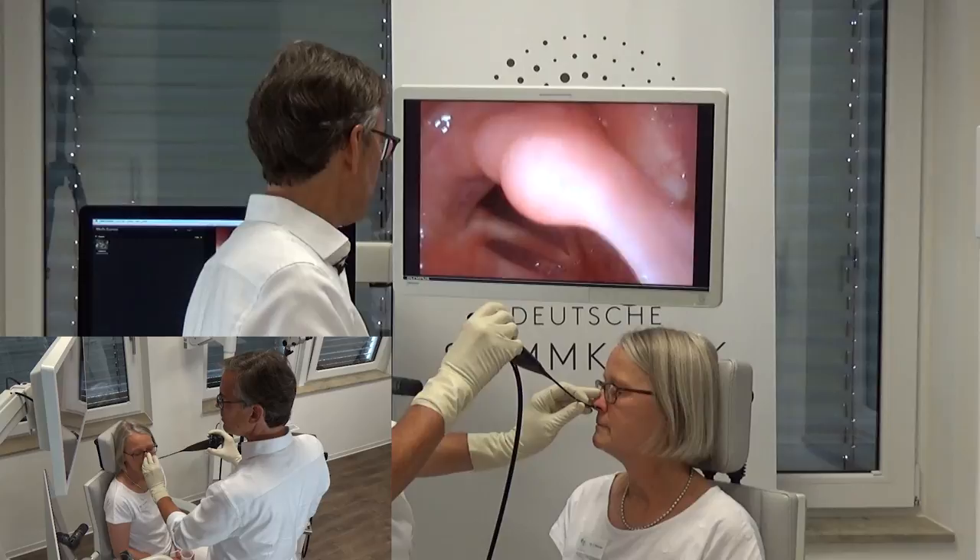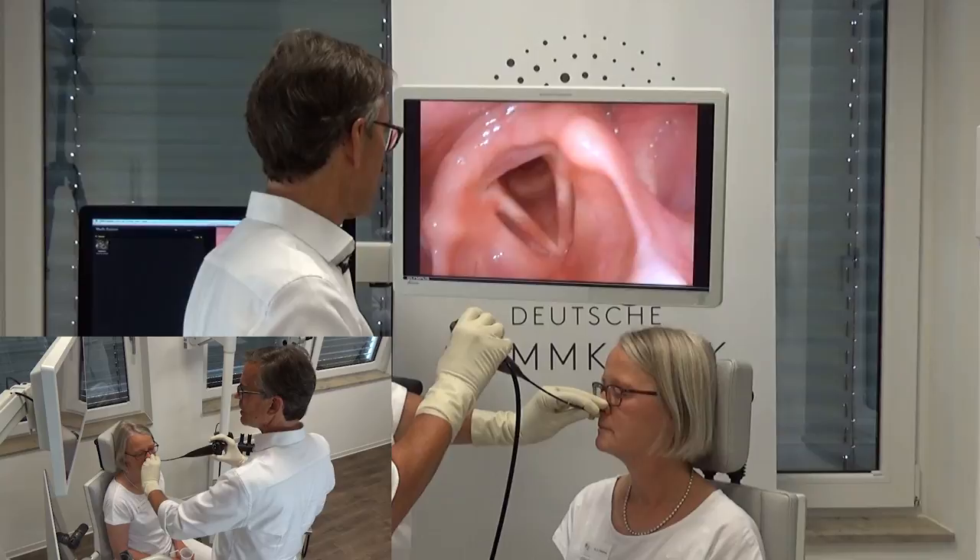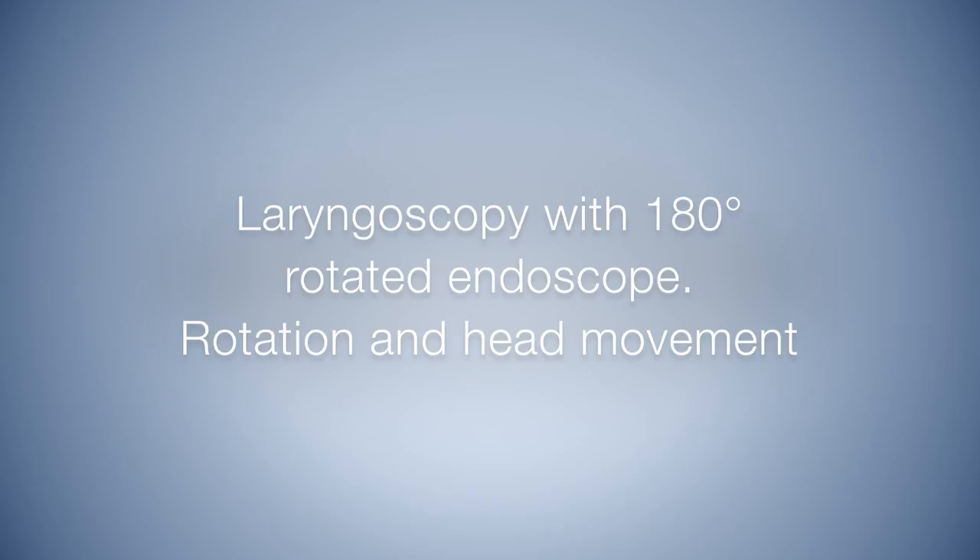As you can see, the right vocal fold is now exposed. I control the patient's head turn with my left hand, and that facilitates exposure.